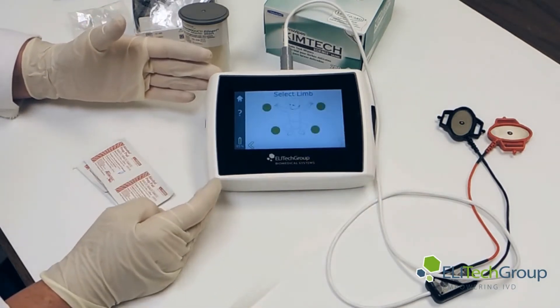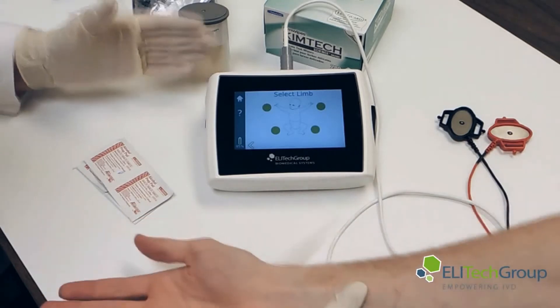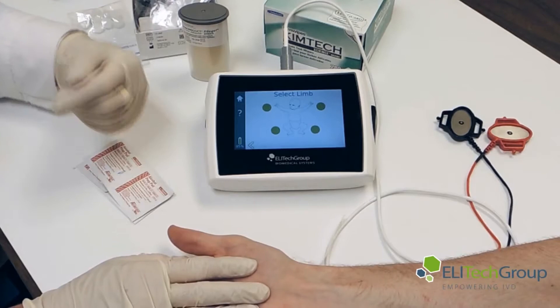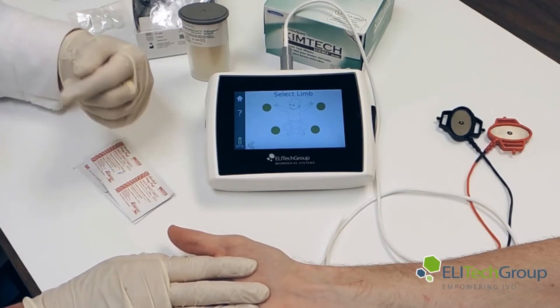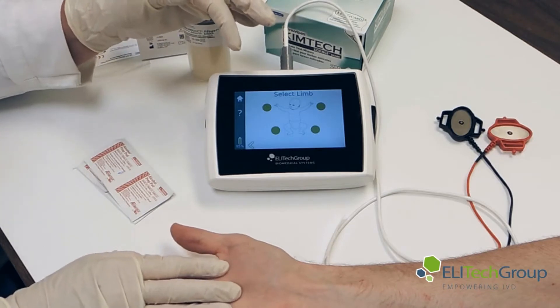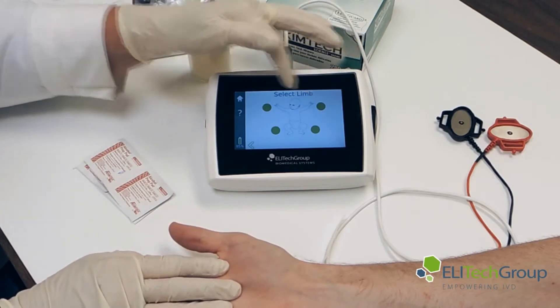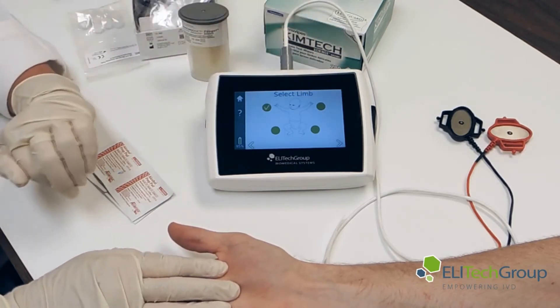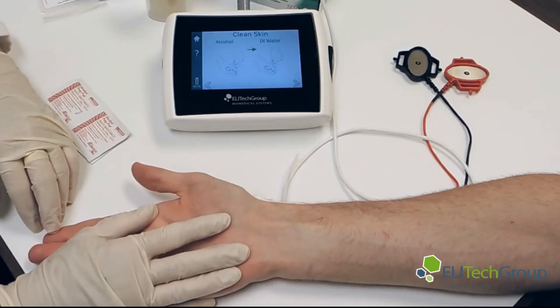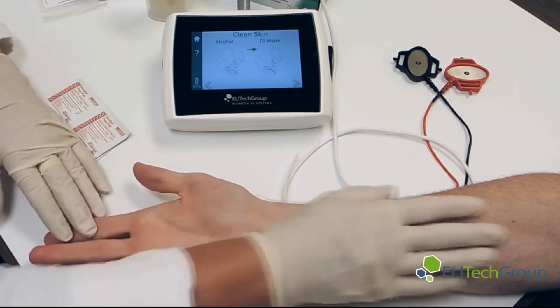We will now select the limb. We have our volunteer here. Now the baby is facing you, so you need to make sure you click the right side of the patient. This time we will be looking at it — we have the right arm.